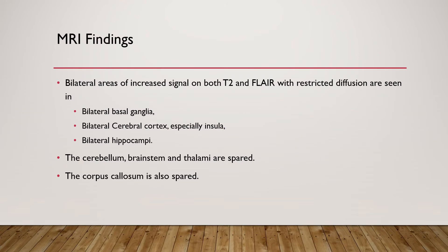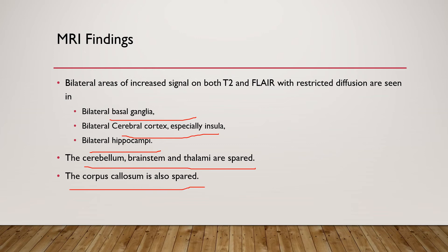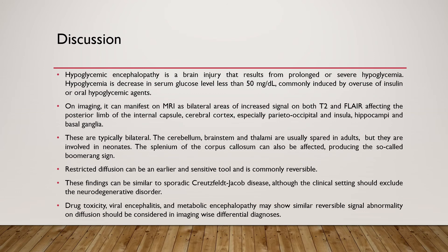To summarize the MRI findings: there are bilateral areas of increased signal on both T2 and FLAIR images which show restricted diffusion in bilateral basal ganglia, bilateral cerebral cortex especially insula, as well as bilateral hippocampi. The cerebellum, brainstem, and thalami are spared. The corpus callosum is also spared. The final diagnosis is hypoglycemic encephalopathy.